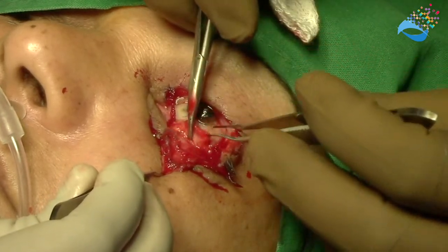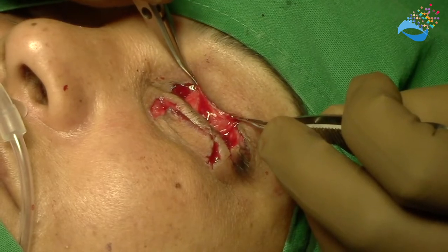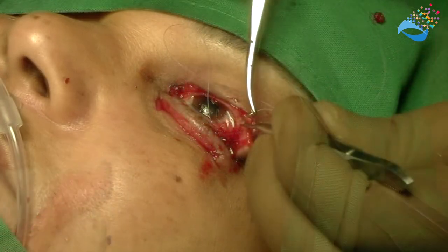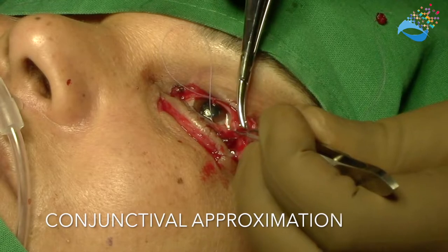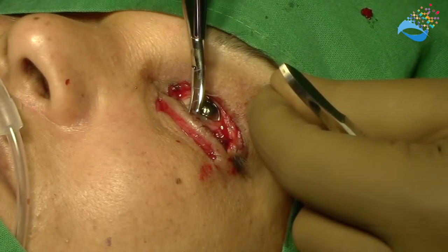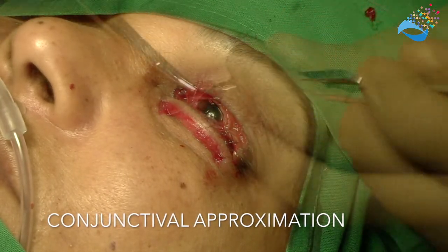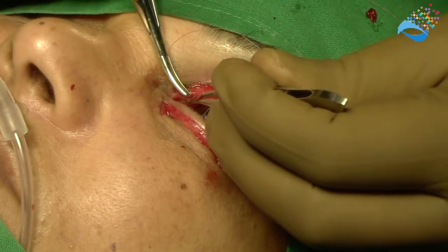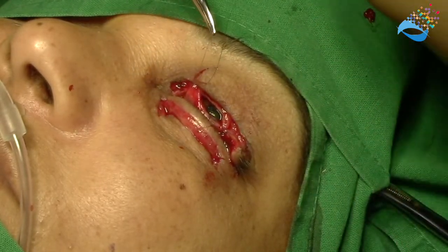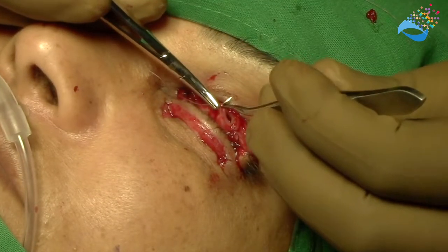The conjunctiva is dissected off this flap and sutured to the conjunctival edges of the upper lid wound. The first sutures to be taken are the ones at the edges. These bites are lamellar and not full-thickness, such that they do not rub the ocular surface. At the central conjunctival suture, one may choose to incorporate a stump of the upper lid levator into it.